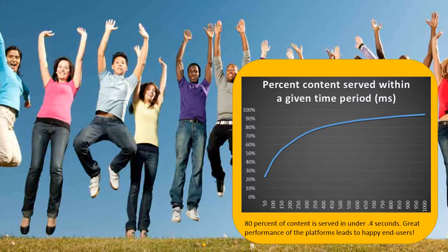In a survey held amongst 91 second and third year undergraduate students, medical school or closely related field, the website was conceived to be easily accessible and very user-friendly, with 87% of participants indicating not to have experienced any problem with the site. 77% indicated that image content was usually or always delivered at an acceptable speed, and 93% experienced the site as easy to use. Furthermore, 84% indicated that the site definitely contributed to their knowledge of pathology.